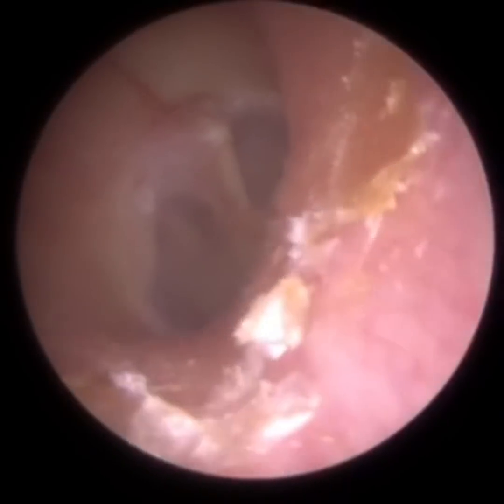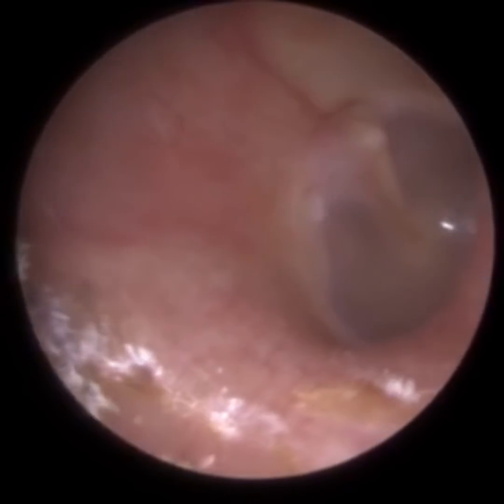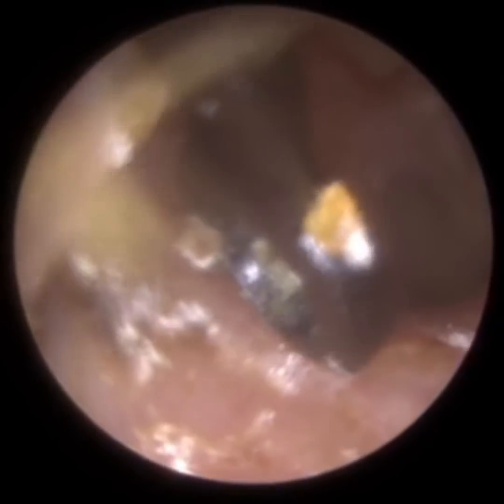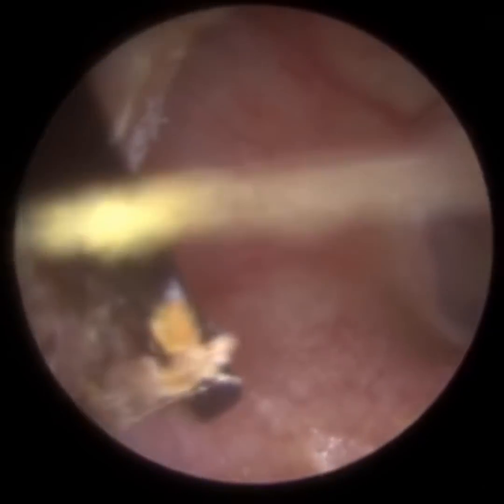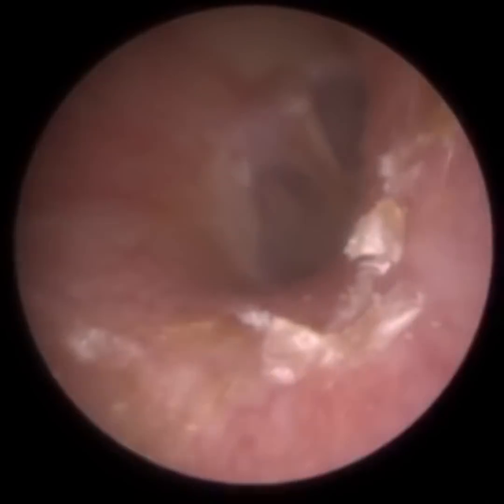You can see we're just using the Jobson horn gently. On the cartilaginous portion we can apply some pressure, but we don't want to be overly aggressive — we don't want to bruise or make the canal wall tender. We're just making contact with it, then rotating the Jobson horn to detach it from the canal wall. In a moment you'll see the third and final patient. That's the patient's eardrum — nice and healthy.